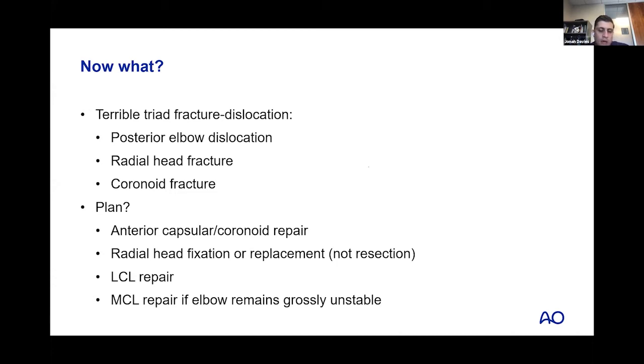If it's a case like Greg's where there's impaction, and now I'm asking the plate to hold up the impaction because I'm restoring that angle, and on top of that, I'm asking it to act as a secondary stabilizer of the elbow, you're going to doom the fracture to failure, and then that fracture is going to fail and it's going to doom the stability of the elbow. So I think probably 3 pieces and more than 30 degrees of impaction, where when I restore that normal angle of the neck shaft angle, then I have to bone graft or something like that.